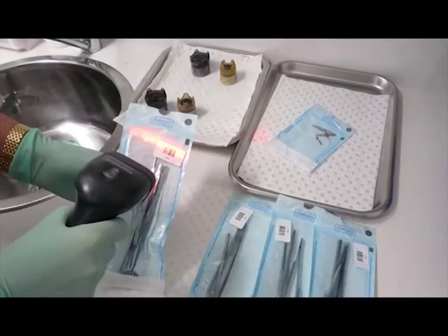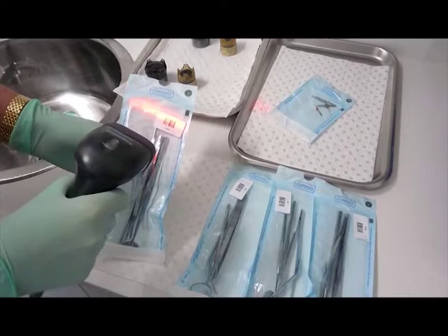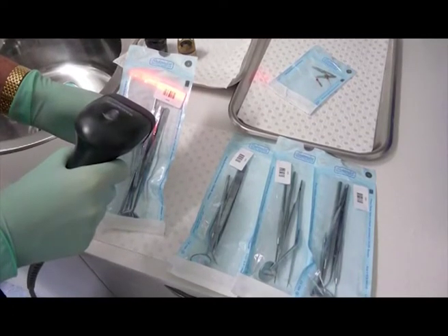The items to be sterilized must first be packed using suitable material. The sterile package has a very important job to fulfill, demanding materials with special properties. The packaging must protect the contents so that they can withstand normal handling without being damaged and also allow sterilization to take place. It must then keep the contents sterile until such time as they are used.